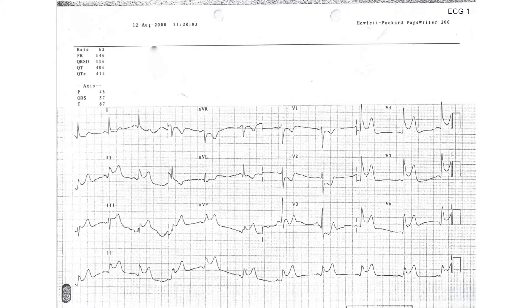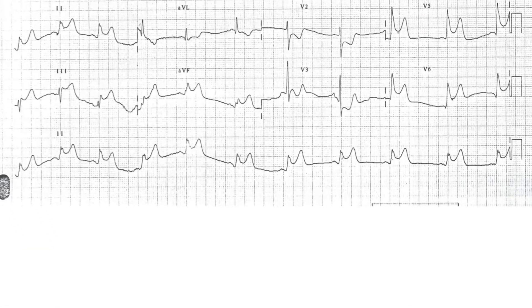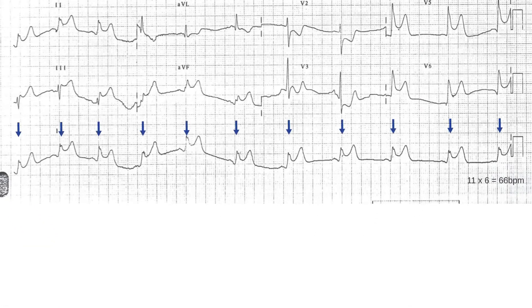The rate is 66 beats per minute. The rhythm is normal sinus rhythm with a P wave present before each QRS complex and every QRS complex preceded by a P wave.